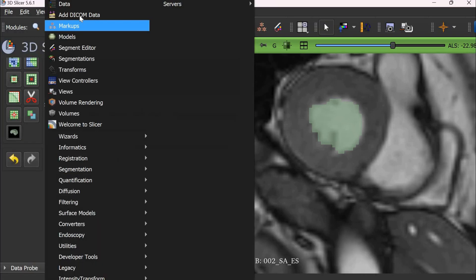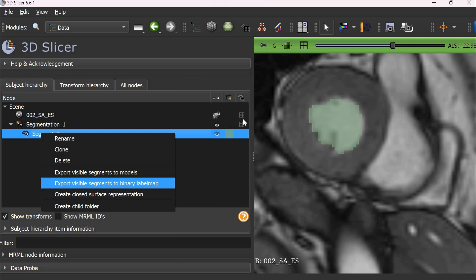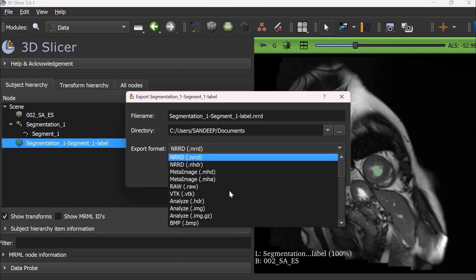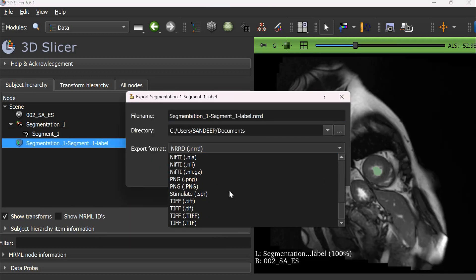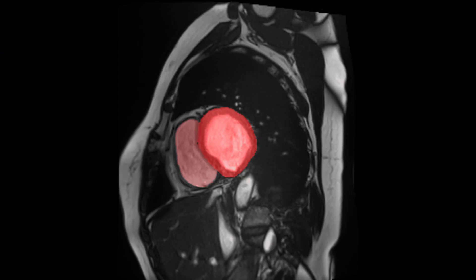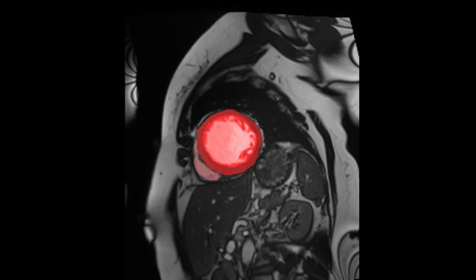To save this mask, go to the data module, export to binary format and then export to file. This is how you can create quick segmentation masks on medical images for deep learning or machine learning applications.